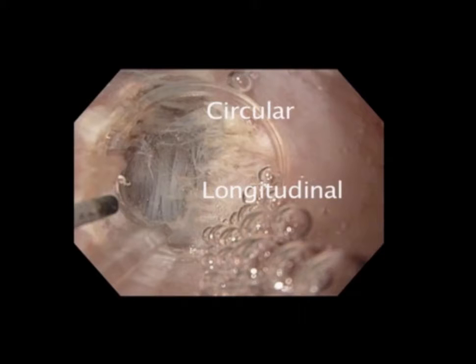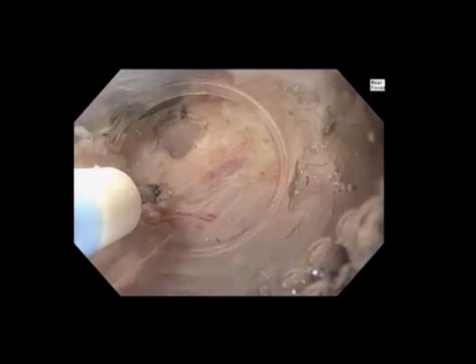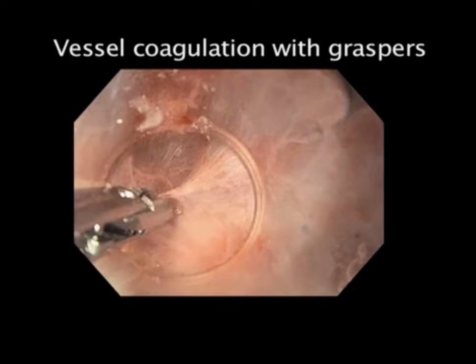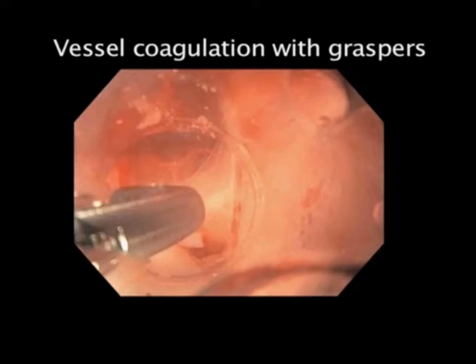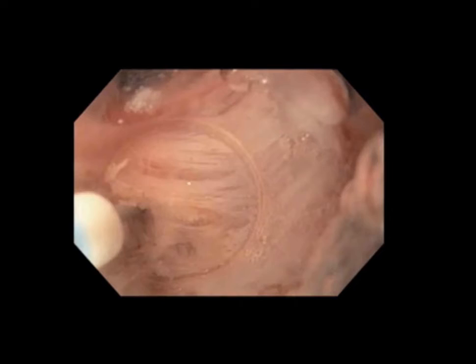As soon as we identify the longitudinal layer, we stop. At the GE junction, the circular layer can be quite thick and we want to make sure we completely incise it. When we have a small vessel, we prophylactically coagulate these — we can see this very nicely underwater. A larger vessel can be coagulated with the coag graspers and we can target this very precisely underwater. If we have a bleeding point, water allows us to identify that point very nicely. We can target it with the graspers and apply coagulation. Prophylactic hemostasis is very important.